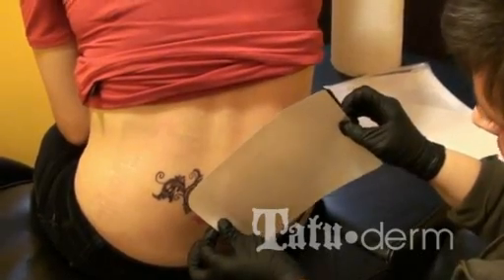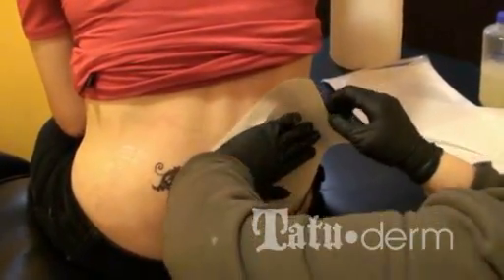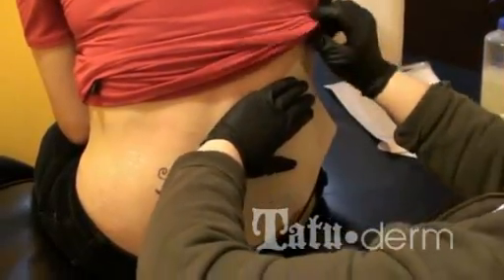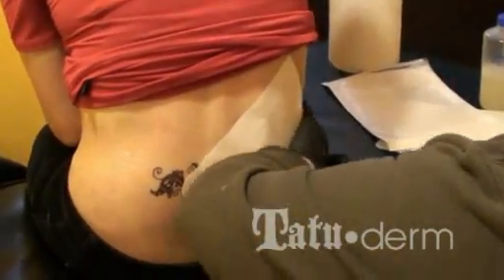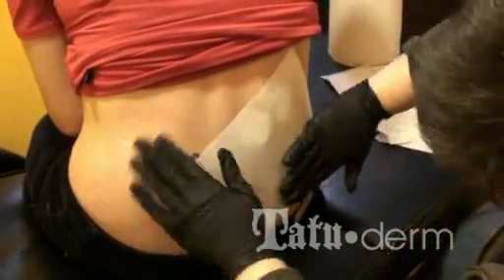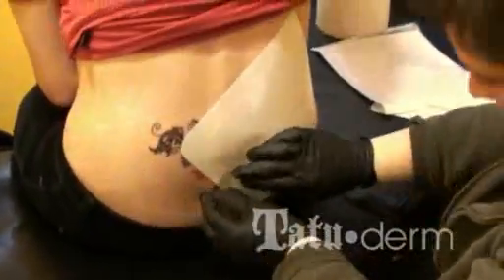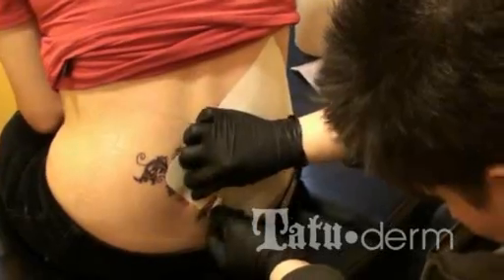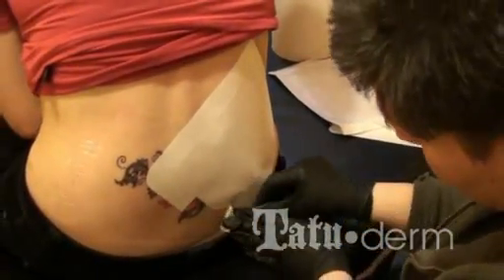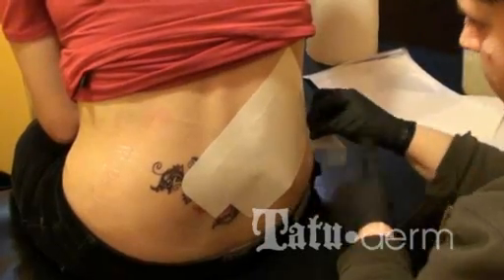Do your second sheet and make sure they cross over, because the tape adheres to itself really well. Pull it down close to itself and pull back — it doesn't pull up off the skin.